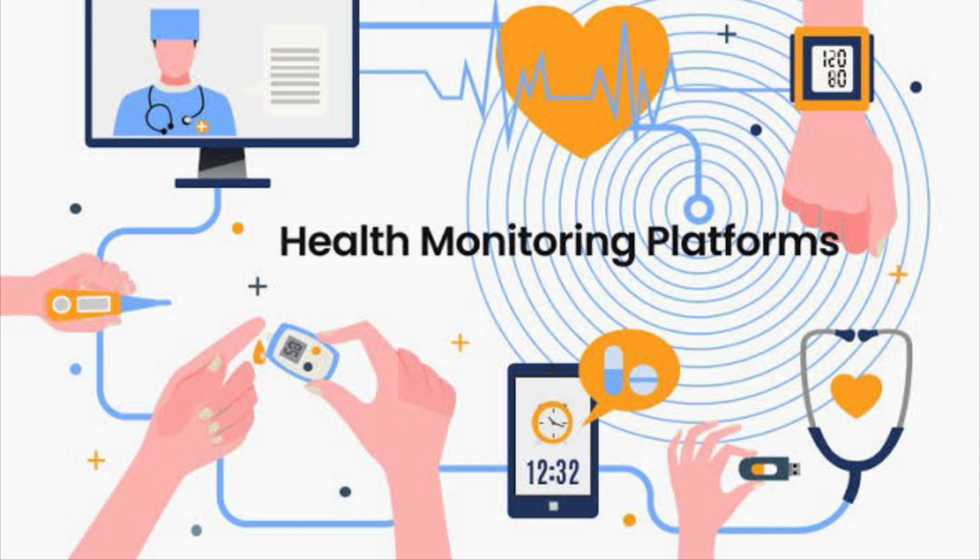Once you've identified the need for starting a wearable continuous vital signs monitoring program, the stakeholders should be identified, and that falls into three main categories. One is from the administration and leadership. Somebody from the administration side has to take the leadership to study the problem and get it implemented. Second is to identify the staff required for this program. And third is to identify the category of patients for continuous vital signs monitoring in the hospital.